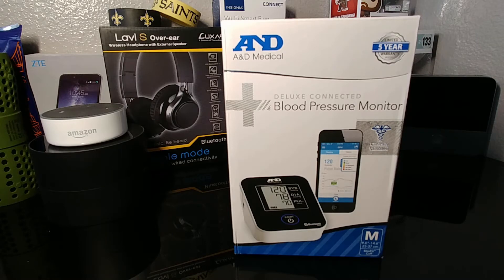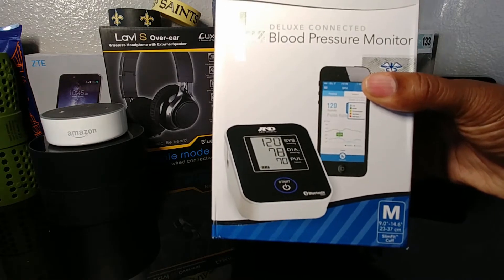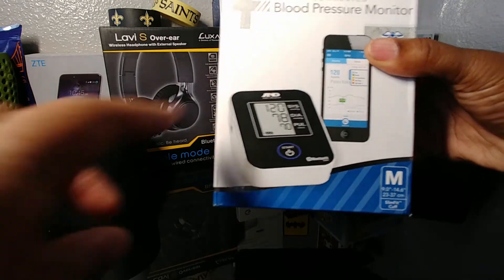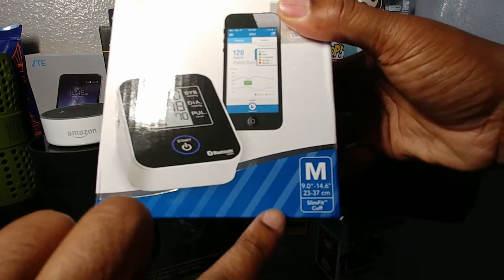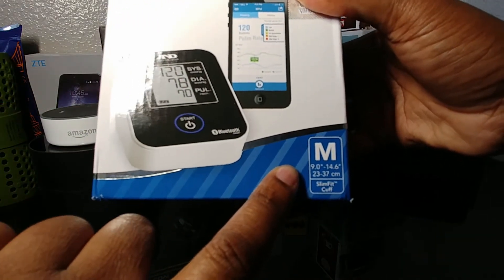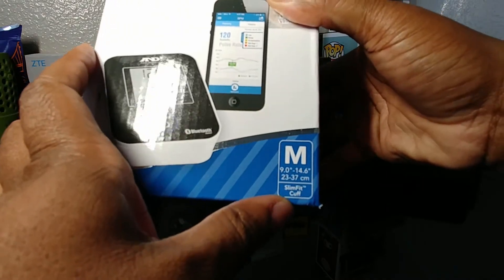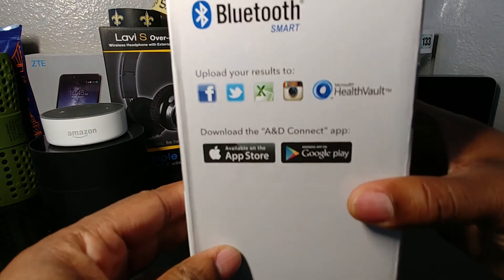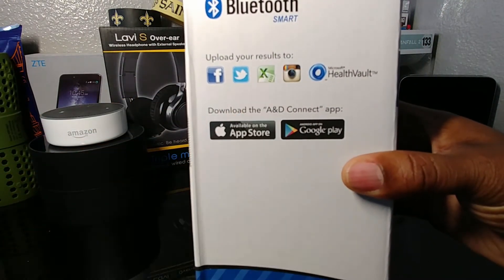Let's take a look at some of the information on the box. It's a blood pressure monitor so it's going to have the cuff and the unit, and there's an app you can download to your phone. This is the medium size slim fit cuff. On the side here you can see where you can upload your results to social media or an Excel file.